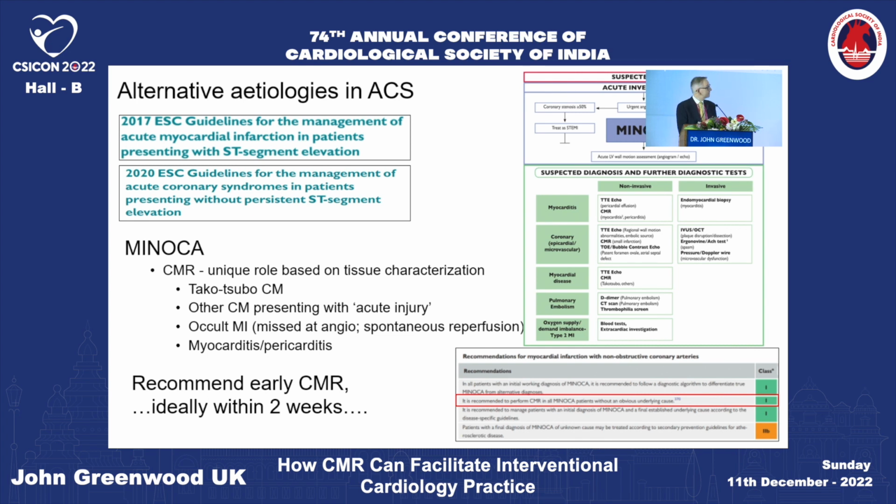And just to highlight the growing utility of CMR, here are a couple of ESC guidelines looking at STEMI and NSTEMI populations, and recognizing that this MINOCA group, the MI with non-obstructed coronary arteries, really does need further diagnostic interrogation, because the underlying diagnosis is quite diverse. And actually they recommend doing the CMR within 2 weeks if possible. I know that's quite challenging.